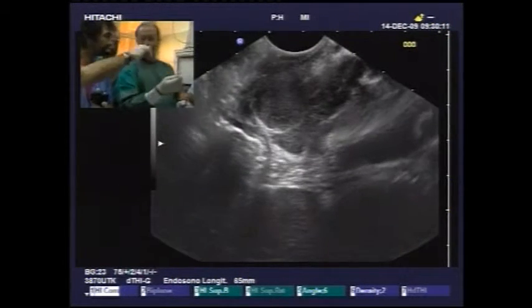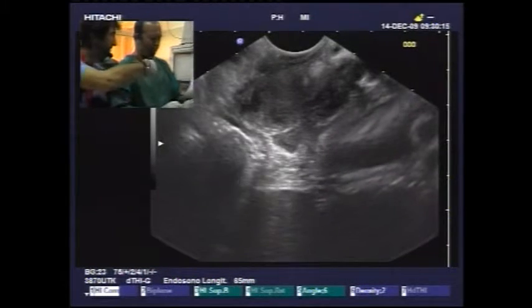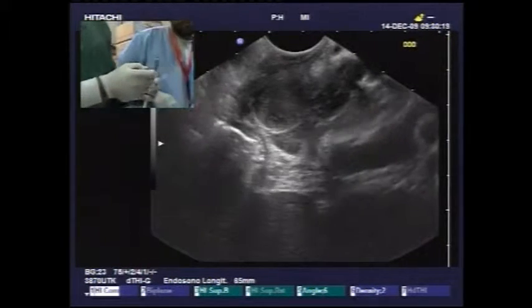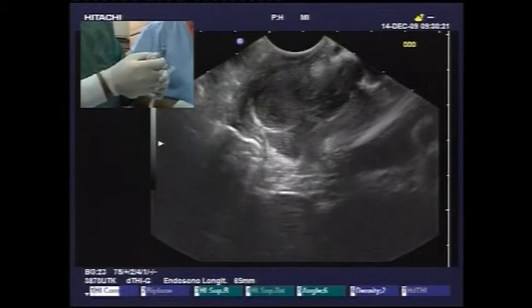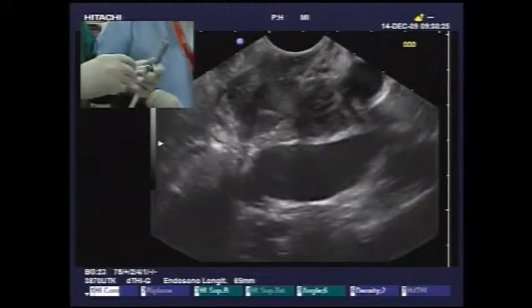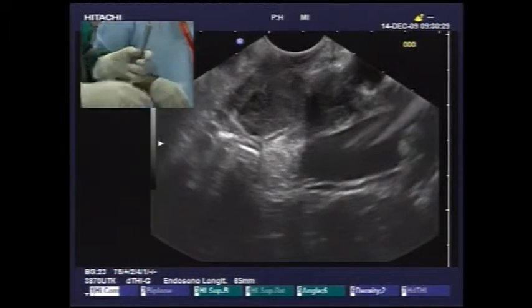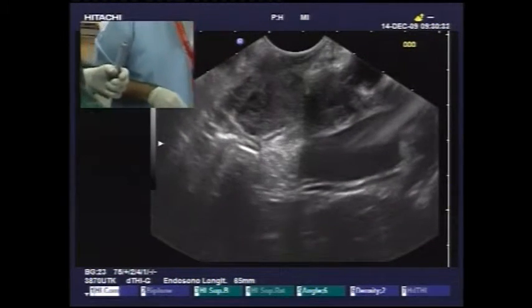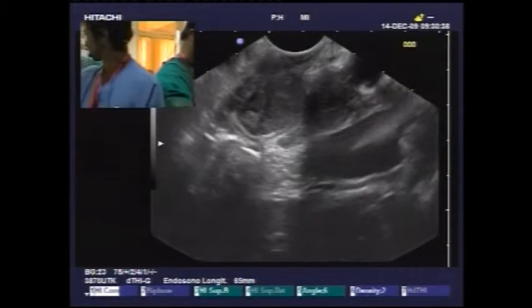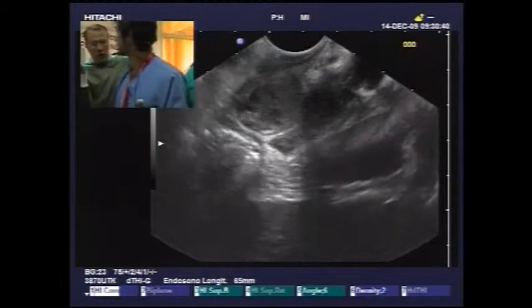Now what I'm planning is that I'll do a sphincterotomy here, put a nasocystic tube to drain the cyst completely, and then I think we'll probably have to go in another day to drain the other system. Yeah, keep injecting. Can you see the fluoroscopy picture? You can see a cystic, large dilated duct also. Then it's going into a cystic space there.